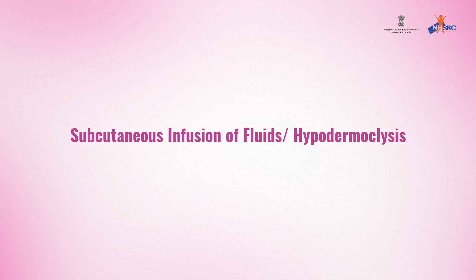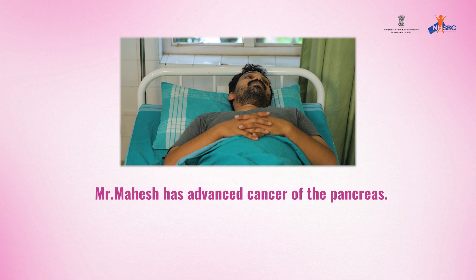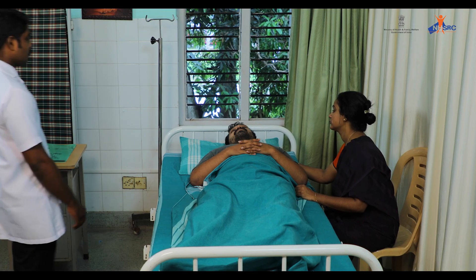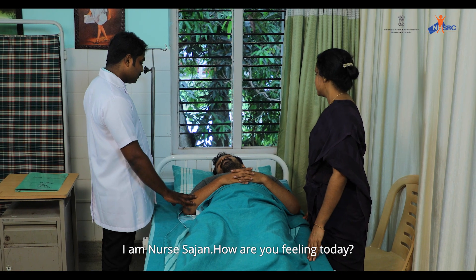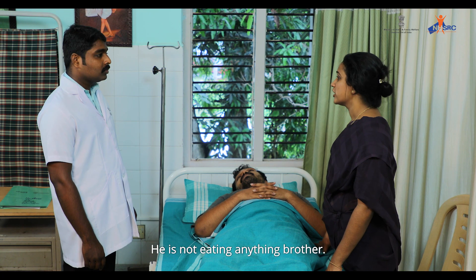Subcutaneous infusion of fluids, or hypodermoclysis. Mr. Mahesh has advanced cancer of the pancreas. Mrs. Lakshmi is his wife and caregiver. Good morning Mahesh. Good morning. I am Nurse Sarjan. How are you feeling today? I am feeling very tired. He is not eating anything.